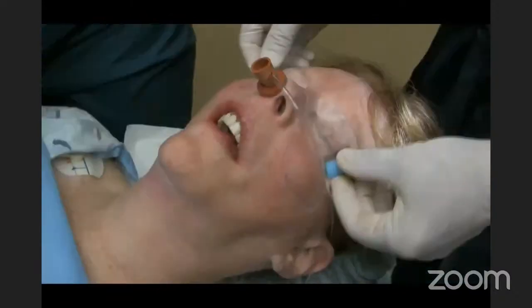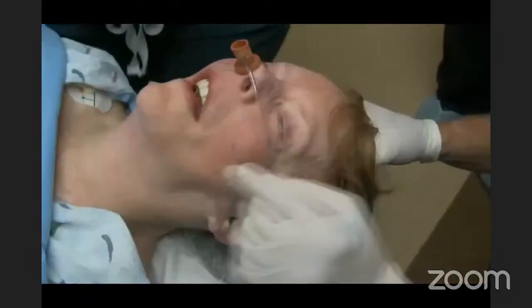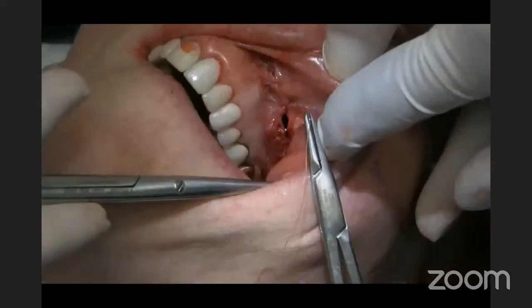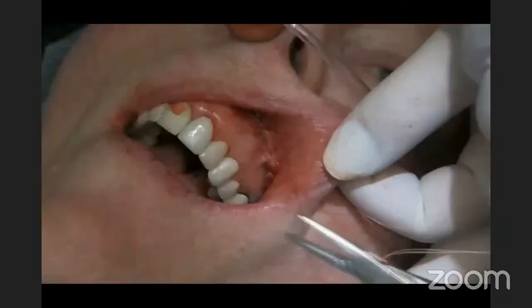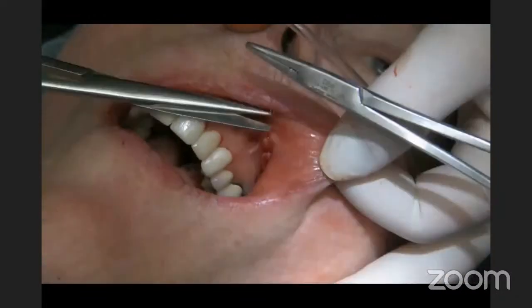Now I'll take a self-drilling screw and place a 6mm screw generally over the thick buttress bone. One single screw just holds the implant in place. I think that's very important. Now I'm lining the superior edge of the implant up, usually between the cuspid and first premolar, and that's an important index to make sure they're both in the same spot.